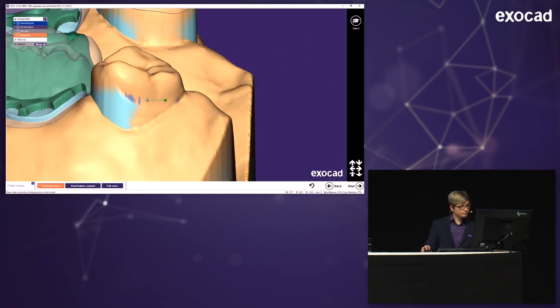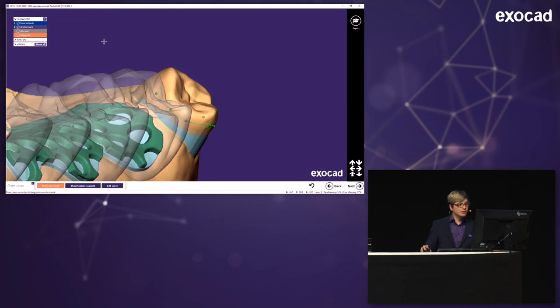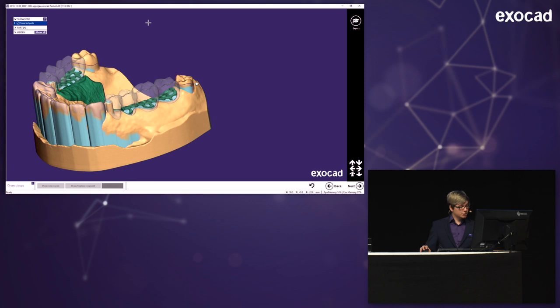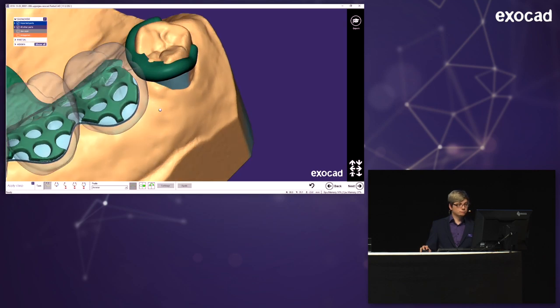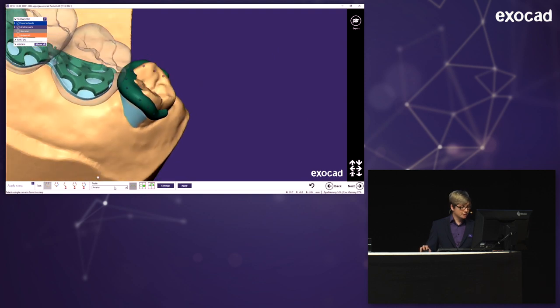For this one, I think I'm going like this. And you could actually draw as many curves as you want, but in this case, we only have two. So they're finished. Now to the next step, where I actually apply the clasps. And just click on one of them. And it gives me a shape of an anterior clasp. But I will change it to a posterior clasp, which is a little bit thicker, as you see.